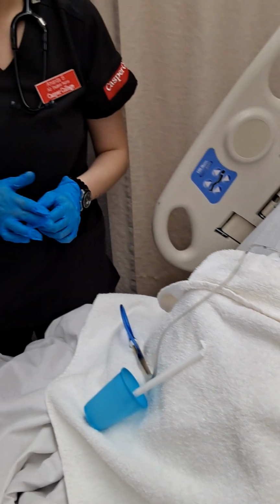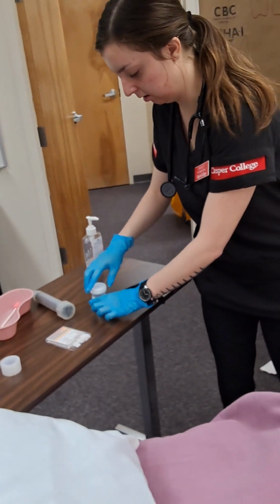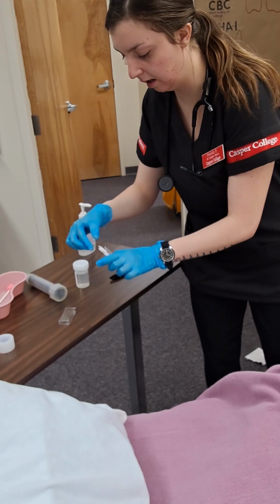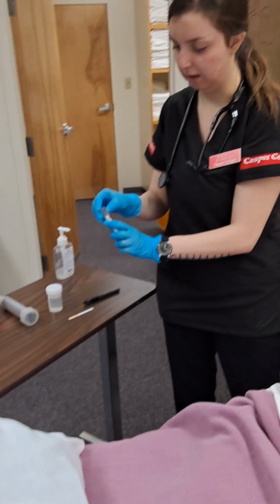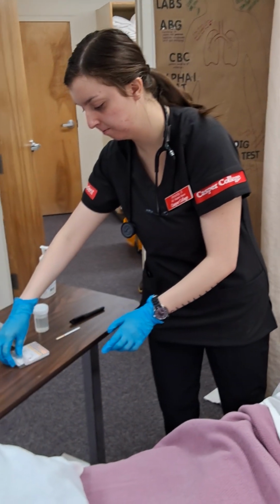Okay, now I'm going to check the pH. I'm going to aspirate the stomach contents. I will also call and confirm an x-ray appointment for him to ensure that the NG tube is in his stomach.